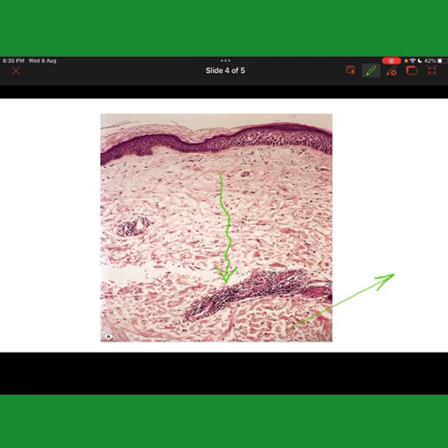So these telangiectatic blood vessels, these stellate fibroblasts or dendritic cells, this deep involvement of inflammation in the dermis, and solar elastotic fibers constitute clues for diagnosing photo damaged skin, along with the epidermal apoptotic keratinocytes.